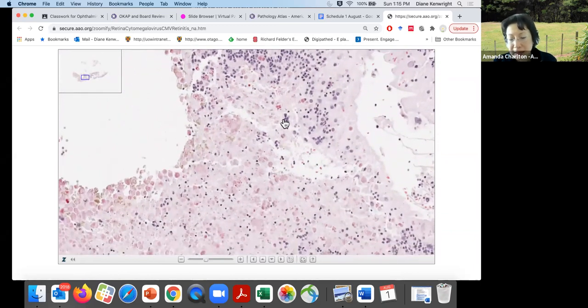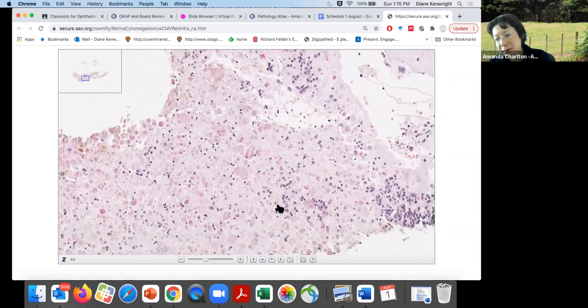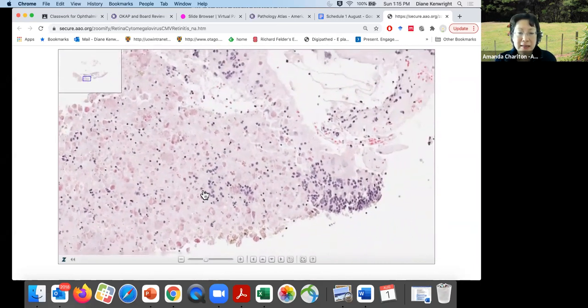Okay, so at the bottom of the screen here, I can see that there is necrotic tissue. There's no structure. It's all fallen apart. I see brown pigment material, which could either be parts of retinal pigment epithelium in macrophages, or it could indicate that there had been some bleeding and some hemosiderin. So I see necrotic retina, I see necrosis, apoptosis, pigment destruction.